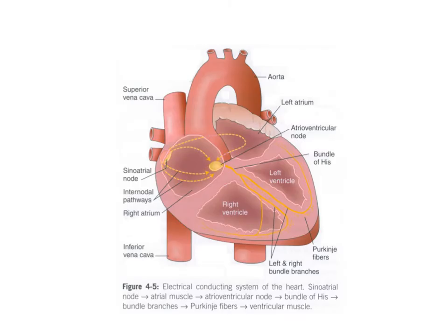So when we're thinking about ECG, the big thing I want you to have in your mind is that it's about electricity and how we capture the electrical activity in the heart. So before we go through the specifics of what an ECG looks like and how we interpret it, I want us to think about how it's generated.